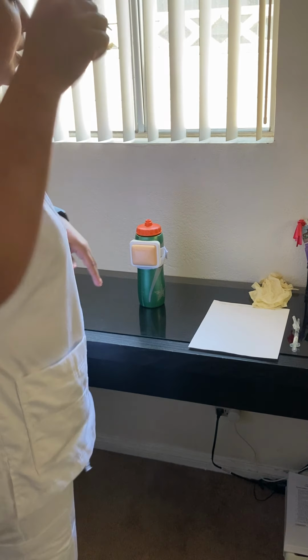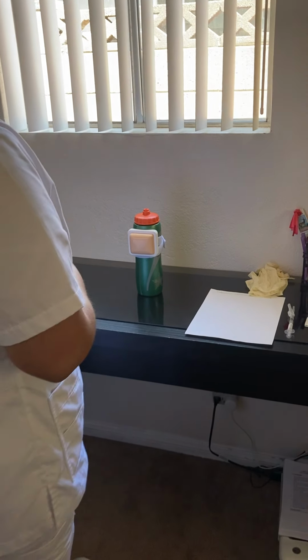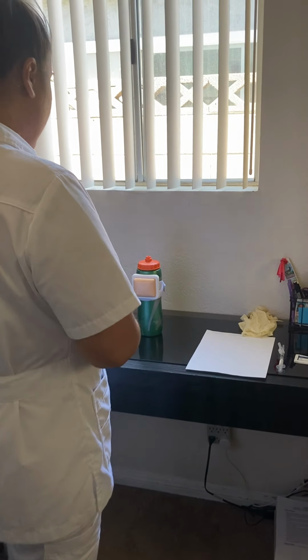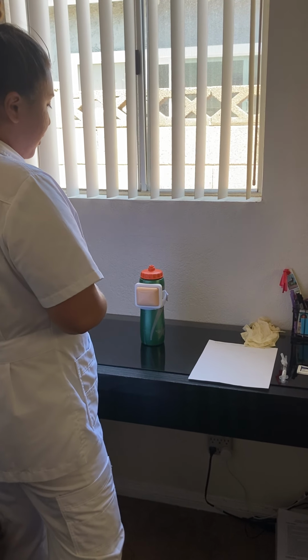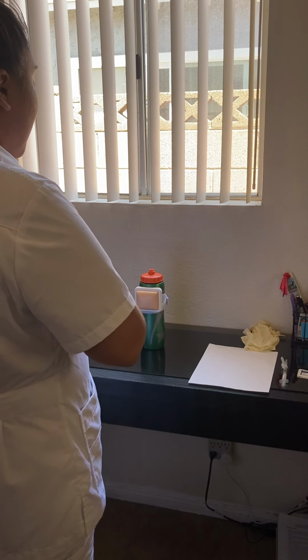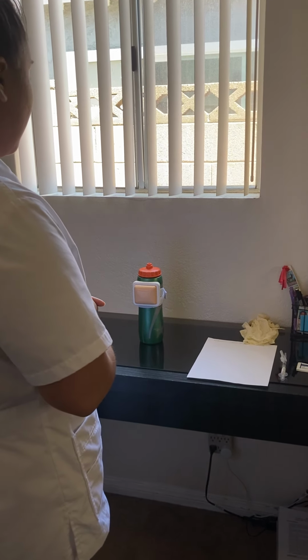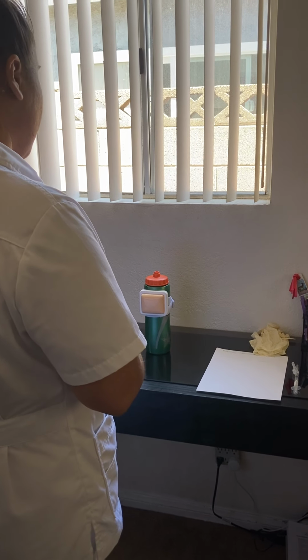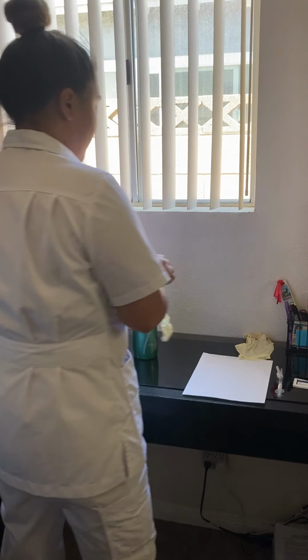I'm going to go ahead and close the curtain or the door behind me to provide privacy. And I'm going to identify the patient. Hello, may I see your hospital wristband? And can I have you state your name and date of birth? Okay, great. I'm going to explain what I'm going to be doing. So today I'll be giving or administering the COVID-19 vaccination. Do I have your permission? Yes? Okay. Thank you. So I'm going to go ahead and apply sterile gloves.